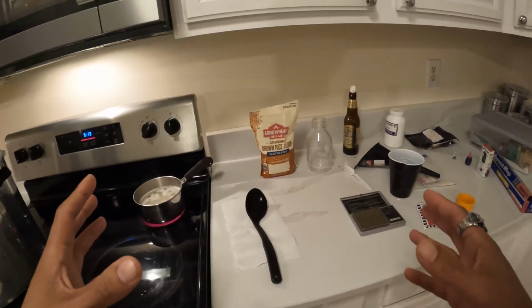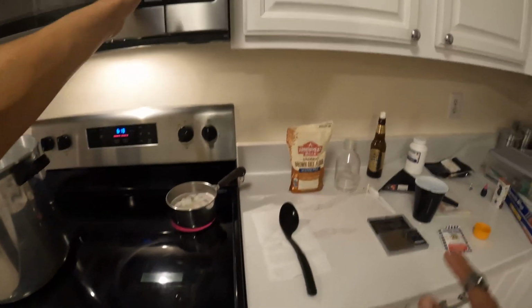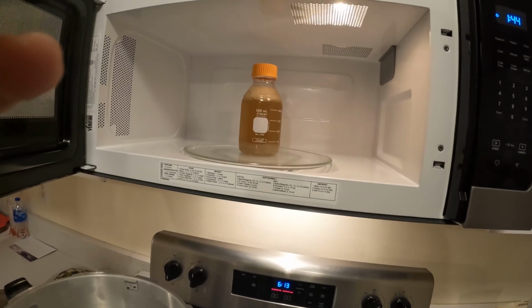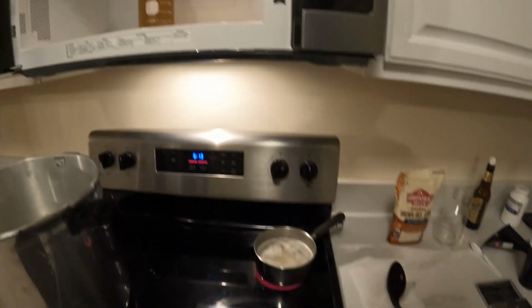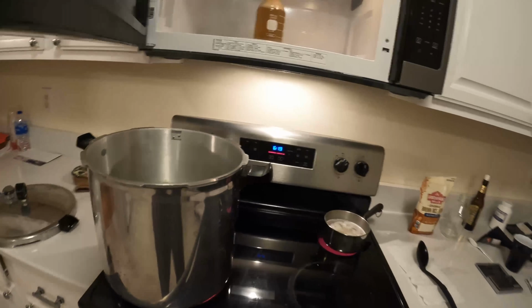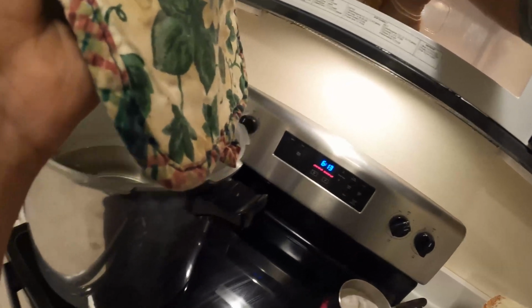Why do you want to know agar? Because agar gets you in the game all the way. See, I don't know if you guys can see that, but it's starting to boil over. You want to keep an eye on it, as I mentioned, or you're going to have a freaking mess. Okay. Let's see here. We can start shaking that. Anyways, you want to learn agar because it gets you in the game all the way.